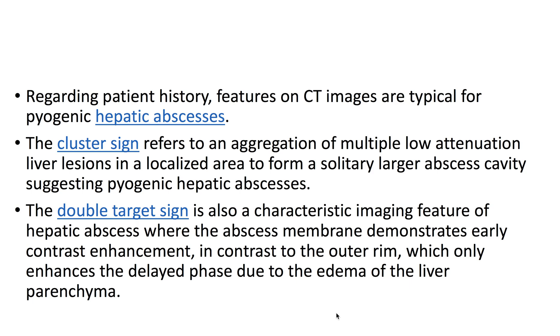Regarding the patient's history and the features on CT, this is typical for a pyogenic hepatic abscess. The cluster sign refers to an aggregation of multiple low attenuation liver lesions in a localized area to form a solitary larger abscess cavity, suggesting pyogenic hepatic abscess.